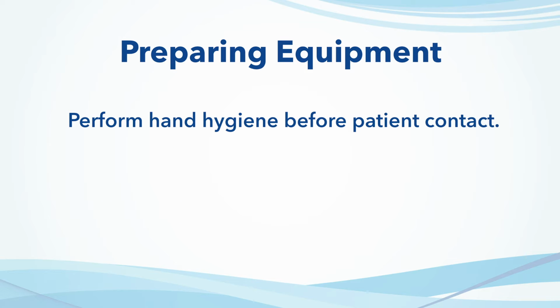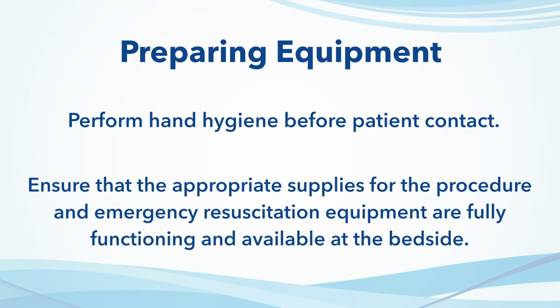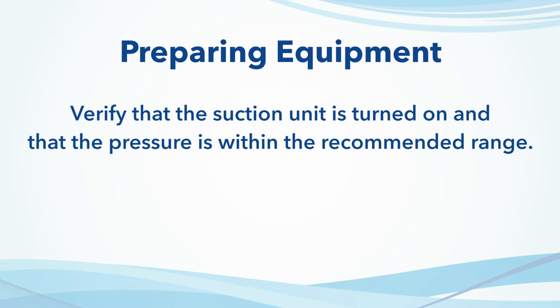Perform hand hygiene before patient contact. Ensure that the appropriate supplies for the procedure and emergency resuscitation equipment are fully functioning and available at the bedside. Verify that the suction unit is turned on and that the pressure is within the recommended range.